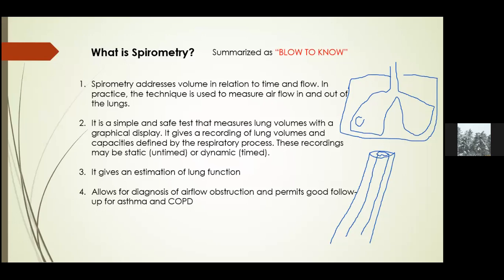Because of that, they limit the passage through which the air can pass. For that reason, a person with such a condition has an obstructive pulmonary disease. Now, if you look at the graph of the spirometer of a restrictive condition and compare it to an obstructive condition, you find that it is very different, and we are going to see the differences.